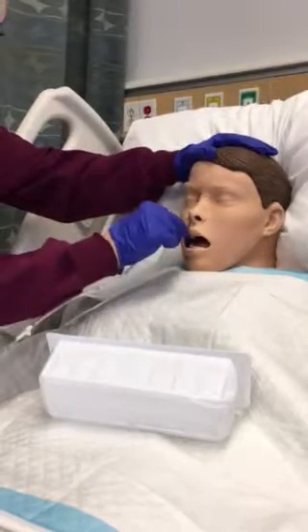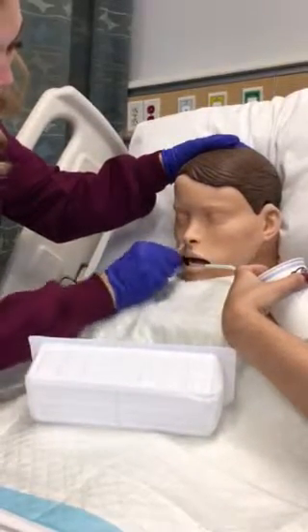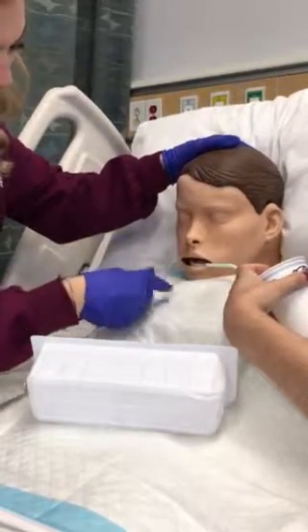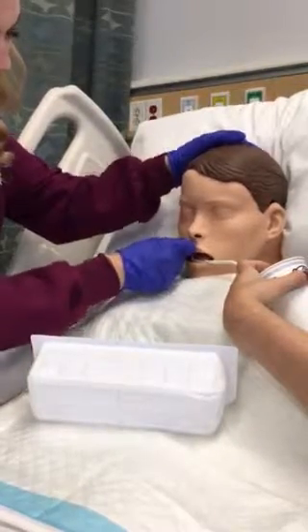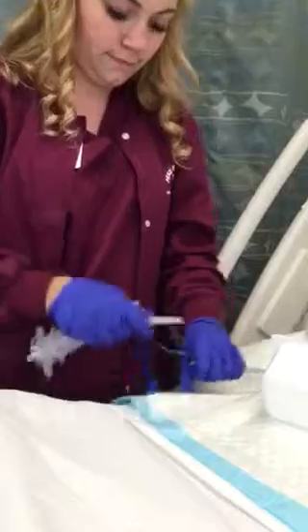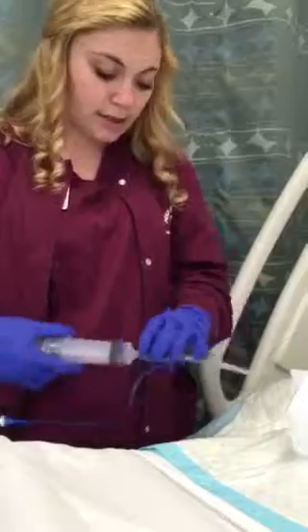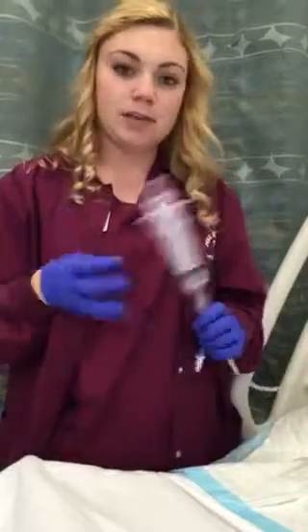Here, we can all use this. Okay, now put your head down and begin sipping water. Okay, keep swallowing, keep swallowing. Okay. I have now inserted it up to the tape. I'm going to take this syringe, attach it to the end, and aspirate to make sure that it's in the stomach instead of in the lungs, and then I'm going to test the pH of this.